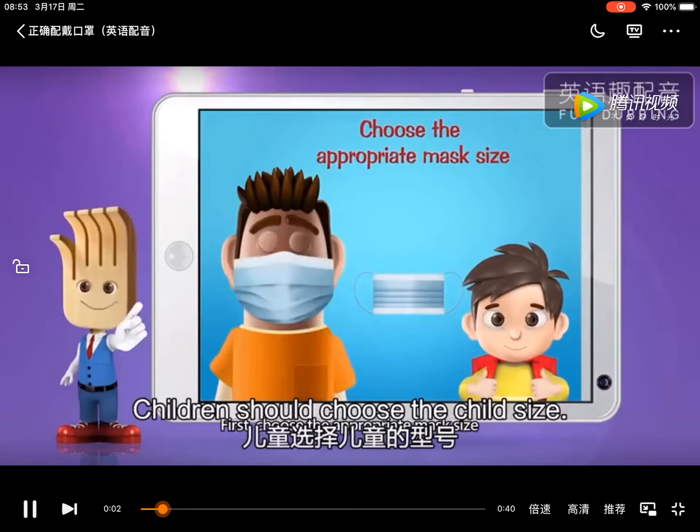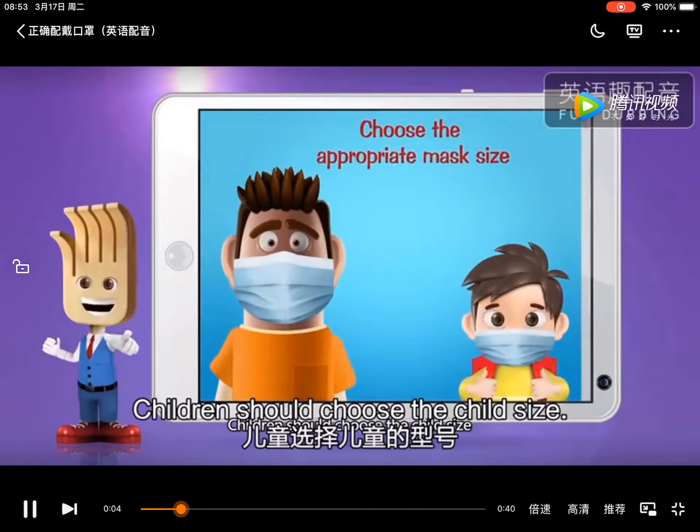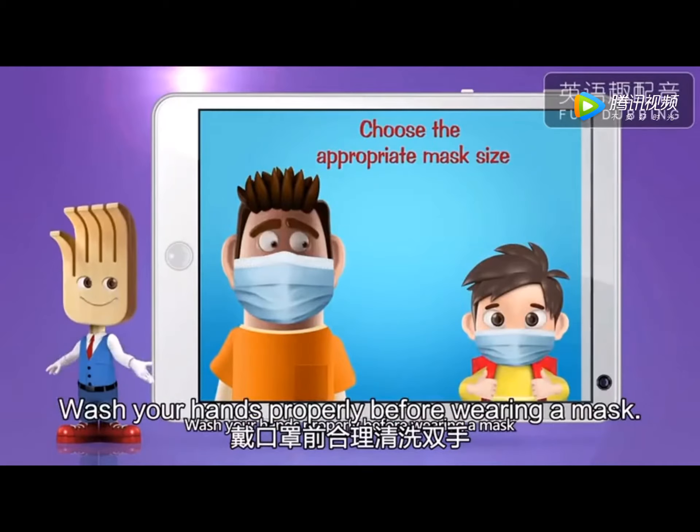First, choose the appropriate mask size. Children should choose the child size. Wash your hands properly before wearing a mask.